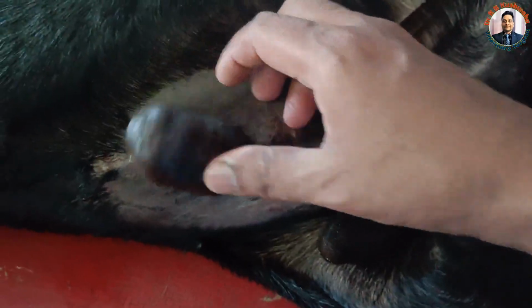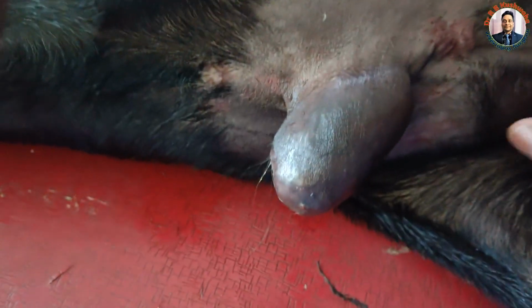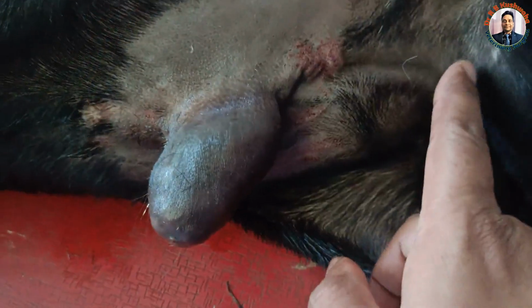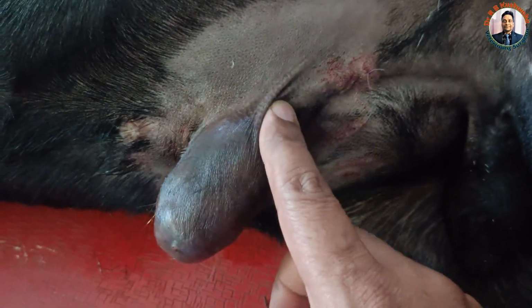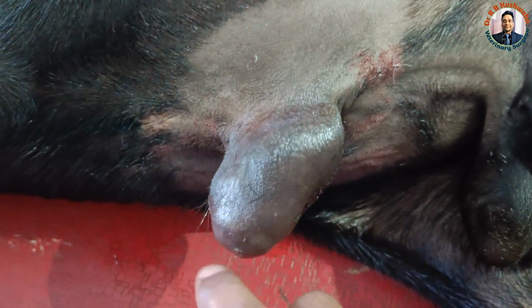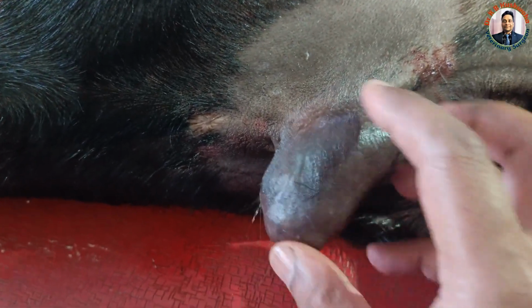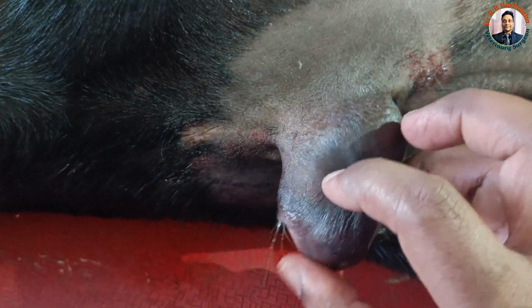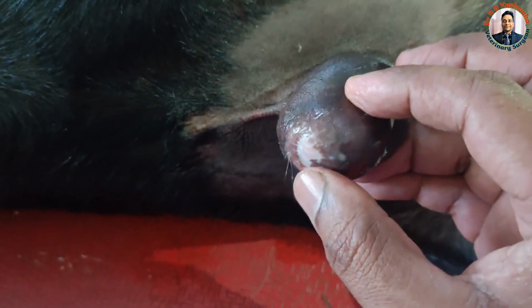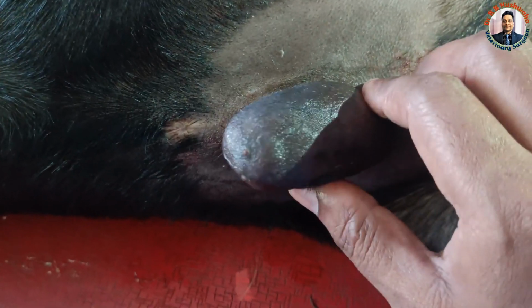Now this animal is in right lateral recumbency, and the scrotum is bifid. Now we could see the most important part: this is the penis, and the urethra runs here on the ventral surface. From here onward the urethra gets dilated, and because of this dilatation the urine accumulates first in this dilated portion of the urethra, and then after straining it comes drop by drop. So there is dribbling of the urine when the animal makes an effort for urination.